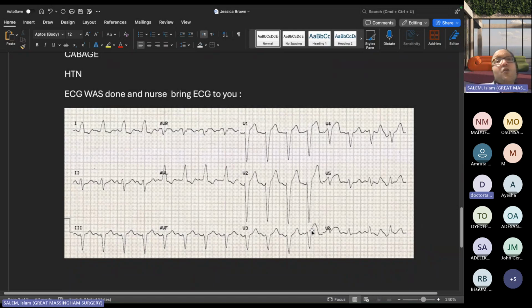If it's more than a certain limit, this is excessive discordance. If it's less than five squares, I guess that's what I remember. Five small squares or big squares? One big square. Which is the smallest square, which I cannot see here anywhere. Do you find it?